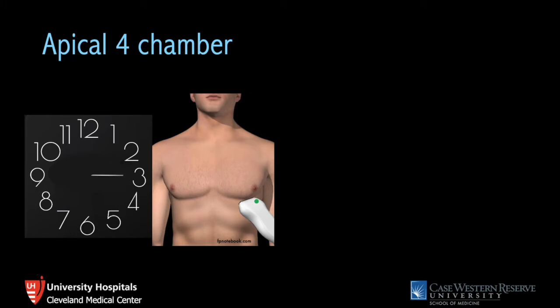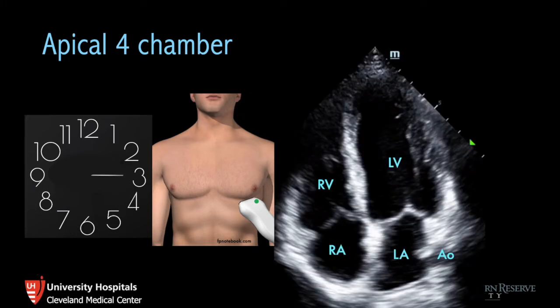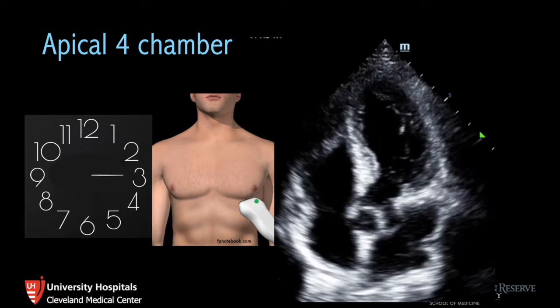For the apical four chamber view, move your probe down to the inframammary fold. Start under the nipple and slide a little laterally depending on the patient's anatomy. You'll see the apex in the near field, the left side of the heart on the right side of the screen, and the right side of the heart on the left side of the screen. Your descending aorta lies just next to the left side of the heart, and that's one way to keep your orientation in check.